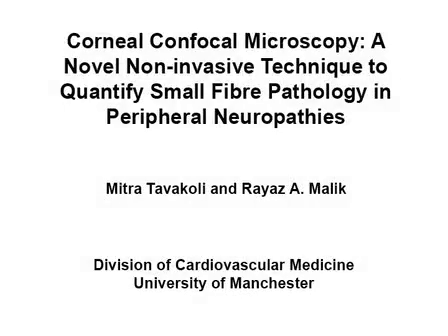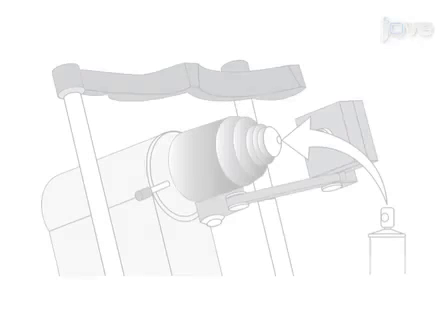This video demonstrates a procedure to image corneal C fibers using the non-invasive technique of corneal confocal microscopy, or CCM, enabling quantification of nerve fiber damage.